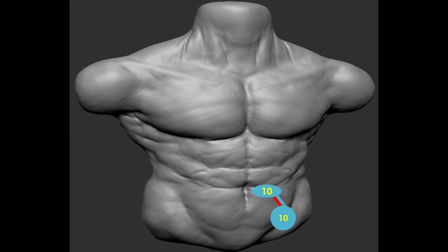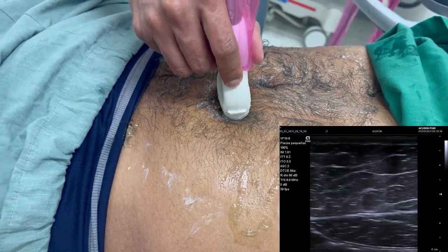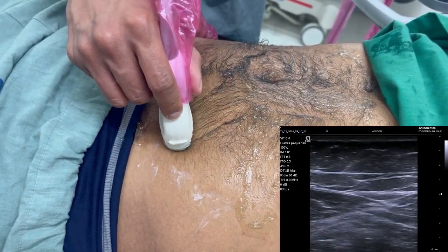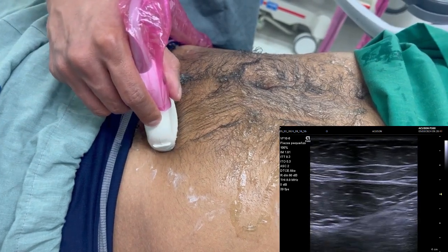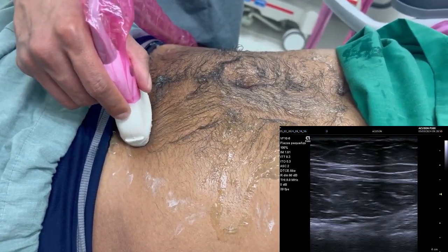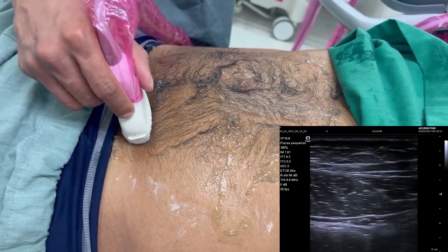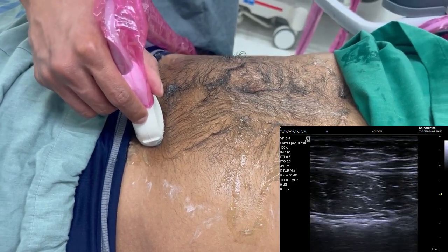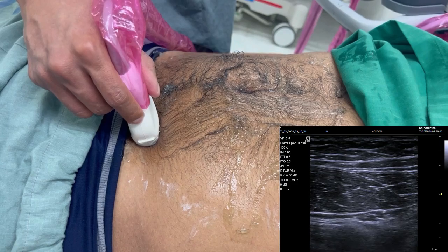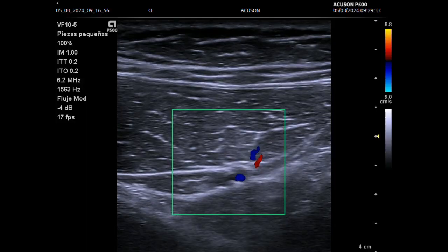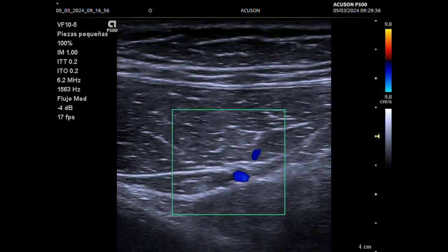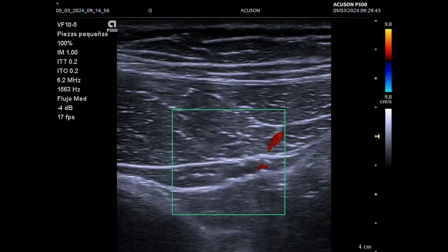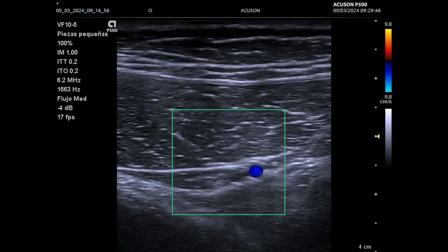In step 10, we repeat what we did in step 9 on the left side. We locate the left rectus abdominal muscle, move caudally and laterally to identify the epigastric vessels posteriorly to the rectus abdominal muscle. Using color Doppler, it is easy to see the epigastric vessels. We also identify the femoral vessels to rule out hernias at this level.